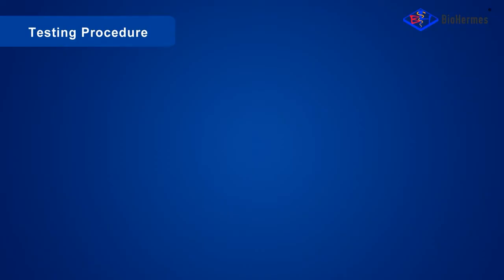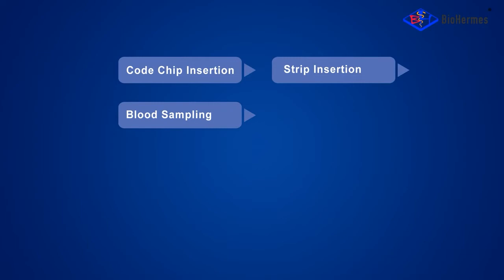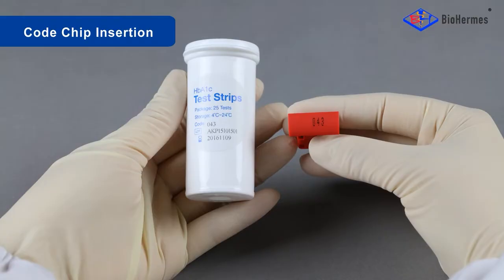The testing procedure consists of the following steps: code chip insertion, strip insertion, blood sampling, buffer A adding, blood adding, buffer B adding, and result reading.